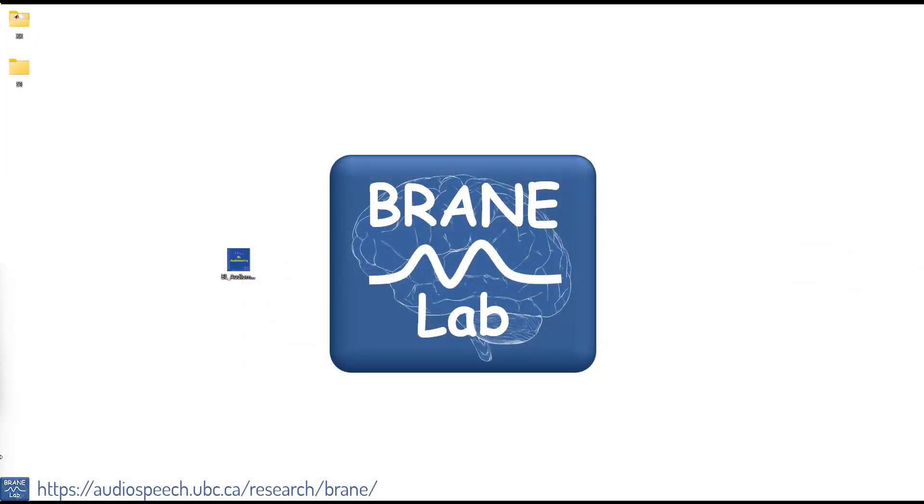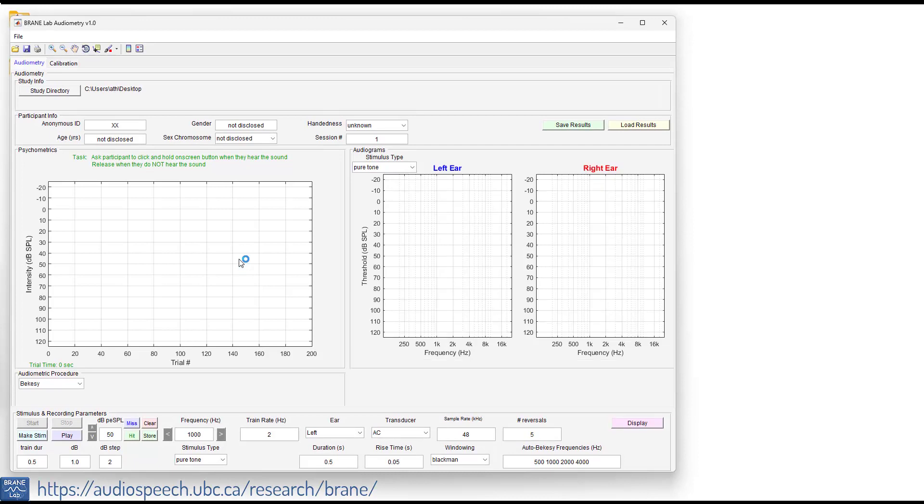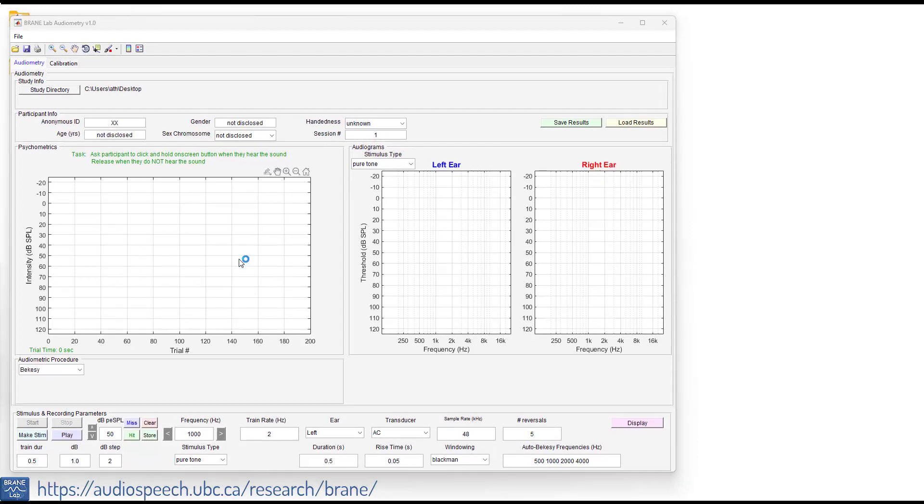Welcome to the tutorial on how to perform the Houston Westlake procedure using the BrainLabs audiometry software. I'm not going to go through all of the components. If you'd like to know the components and features of the BrainLabs audiometry, check out the tutorial on how to conduct the automated Bekesy testing using BrainLabs audiometry software. So let's get right into it.